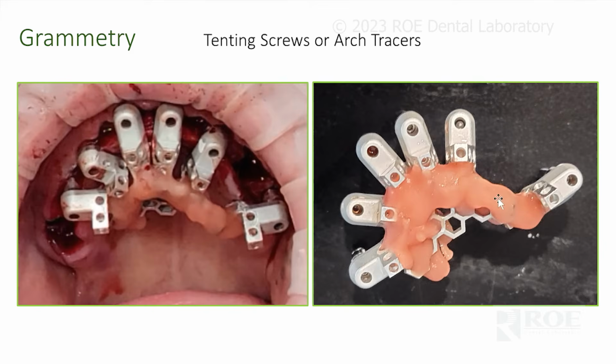Okay, this is a stellar material, it's a light cure material. And one of the things you want to be very cognizant of is that you don't want to have this material out over any of the scan body area, right? Only back here on the vertical part of the frame and the horizontal part of the frame, right in here. Okay, so that's nice and luted, and that's removed. You don't scan it in the mouth, you always scan it extra orally.